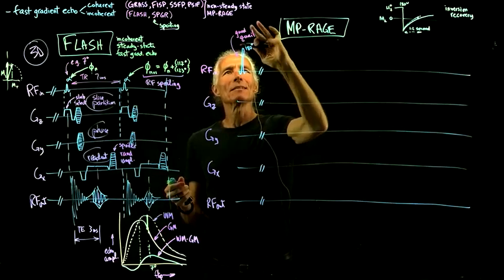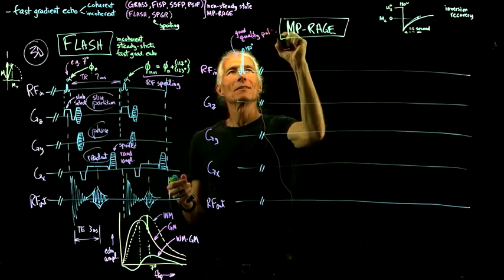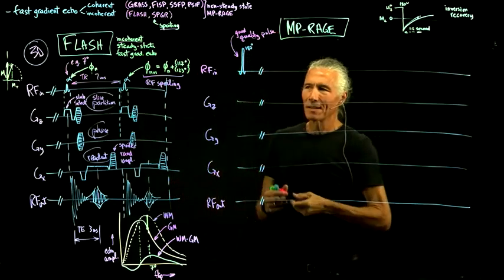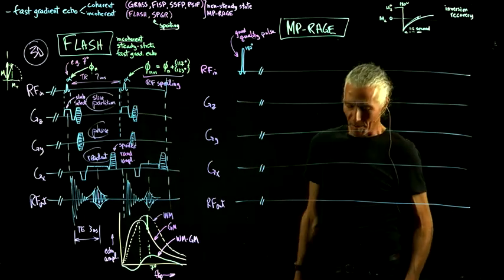I haven't talked about these, but a good quality pulse takes longer. But you have some time, so you can do a good quality pulse.